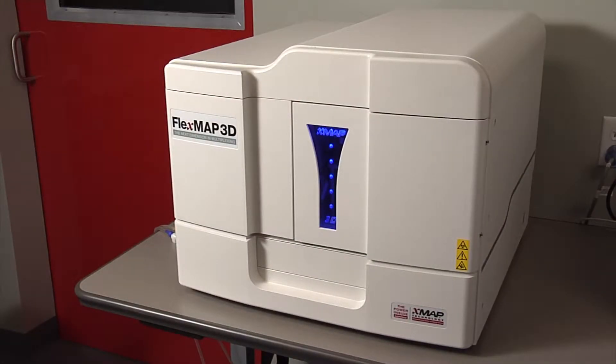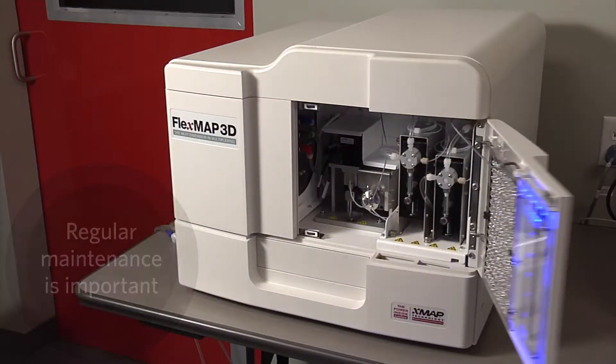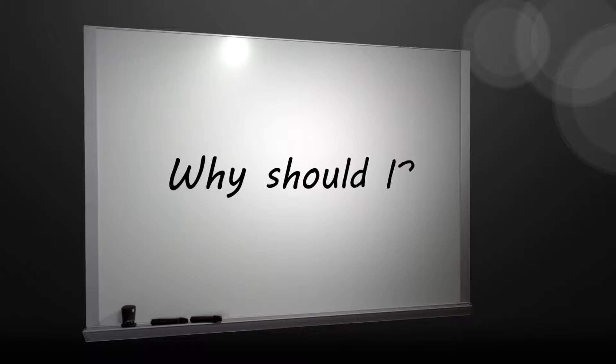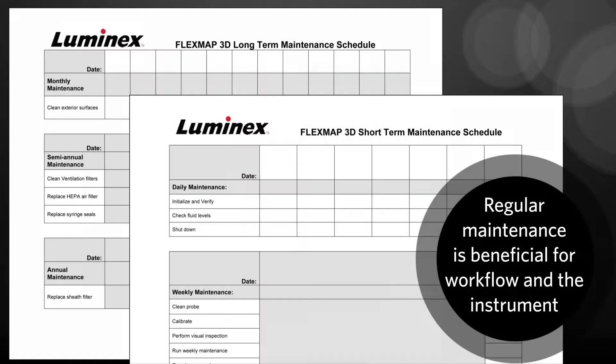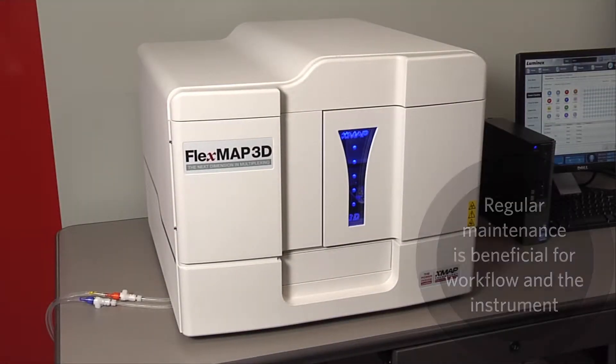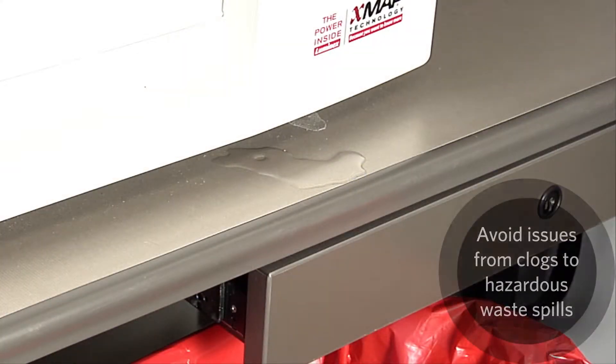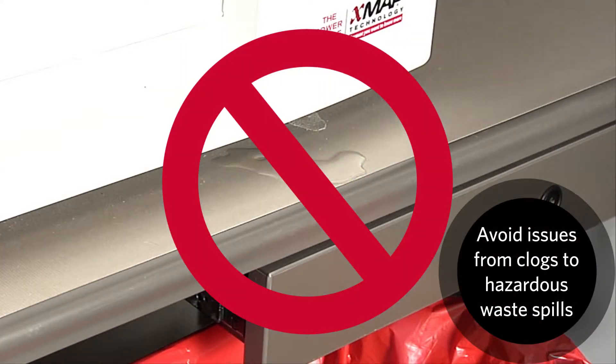One of the most important things you can do for your FlexMap 3D instrument is regular maintenance. Following the regular maintenance schedule is beneficial for both your workflow as well as keeping the instrument in great working order. It ensures the most accurate test results as well as proactively avoiding issues from clogs in the instrument to a hazardous waste spill.